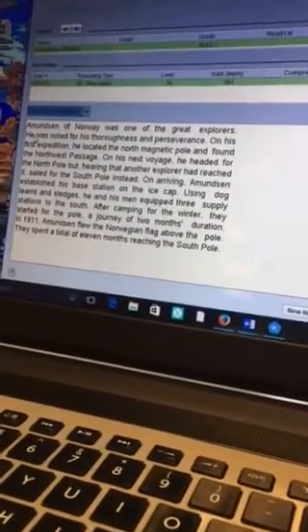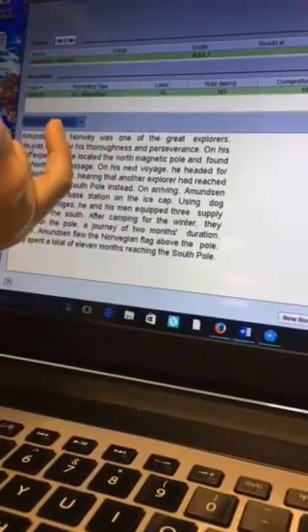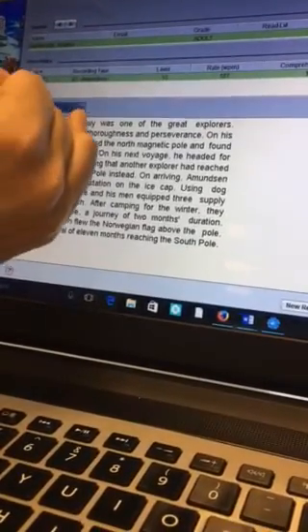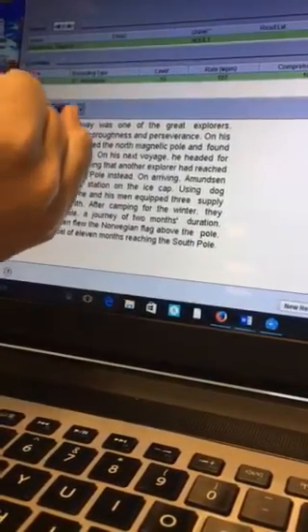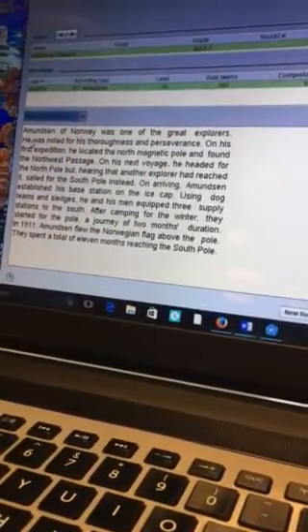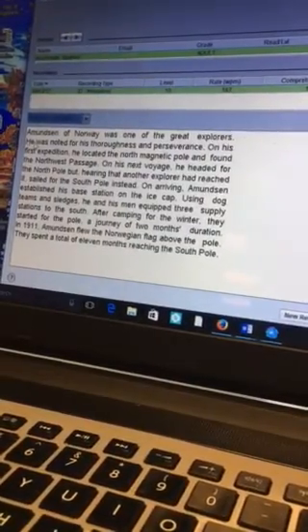The younger reader is expected to have more pauses and more of what we call regressions, where your eyes move backwards. The first grade reader is going to decode letter by letter and then go back and read the word and move forward from there. So the younger the reader, the more okay it is to have additional pauses and regressions. The older the reader, the fewer pauses and regressions we should have.